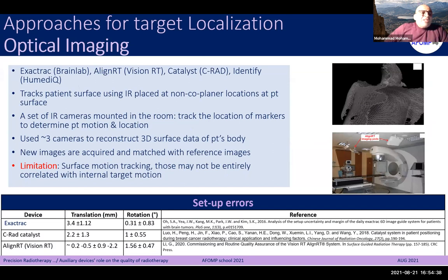Other devices like ExacTrac, AlignRT, VisionRT, and Catalyst or C-RAD can be used to make surface images, and the surface images can be compared with reference surface images collected on the first day of the treatment as reference images. And if there is any issue, we need to have more investigation.